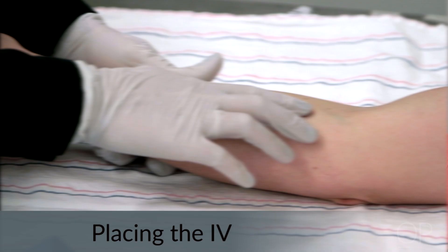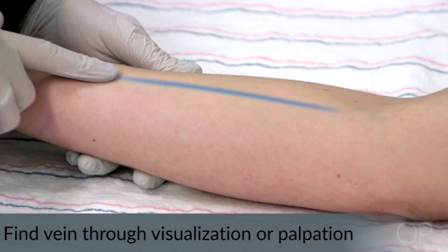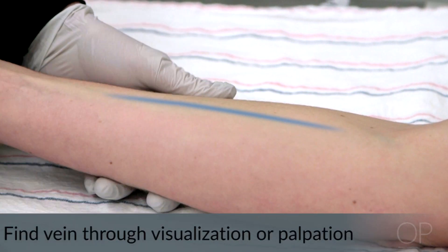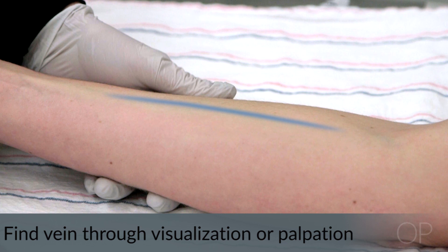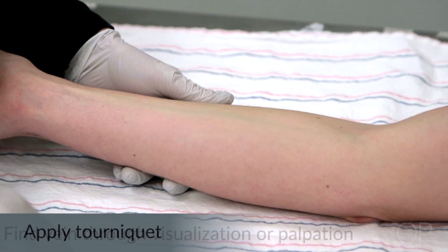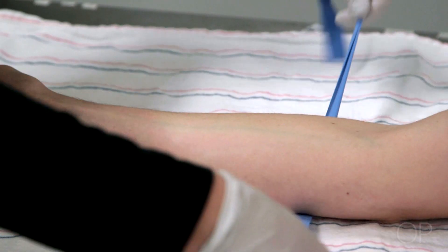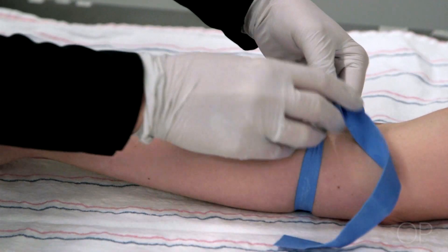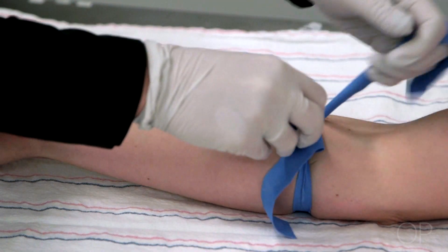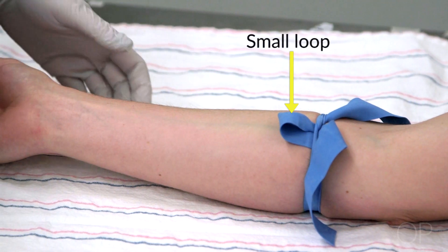To place the IV, first find the vein by visualizing it or palpating for a bouncy tube. Sometimes you will need to place the tourniquet first to help fill the veins with blood. Apply the tourniquet by looping it under the patient's extremity, pulling both tabs upward, crossing the ends over each other, pulling one tab behind and under the other, and pulling it partially through to create a small loop but not all the way through — this leaves a tail for easy removal.